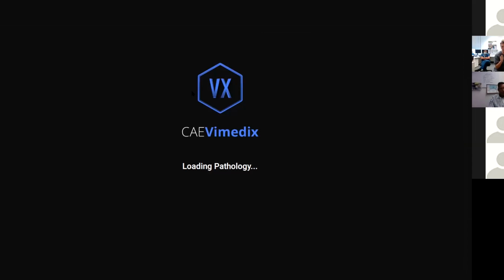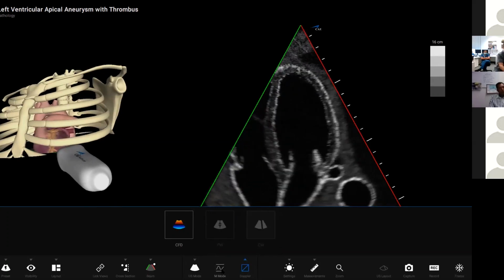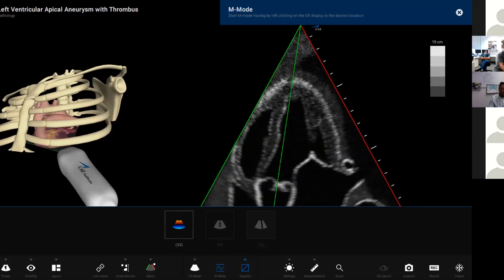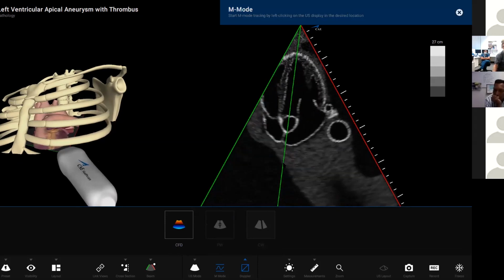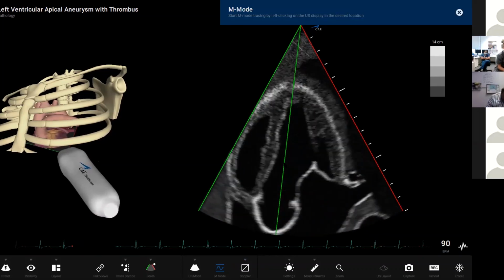On decent echo machines, when you go over what's known as the Nyquist limit with your pulsed wave Doppler, you get multiple gates formed. Sorry, the pathology I've chosen doesn't show it. If we had the M mode coming down through here, imagine that's pulse wave Doppler, trying to find your cardiac output. If the depth is like that, you're going to get multiple gates. So the best way to get rid of those gates is to reduce your depth.